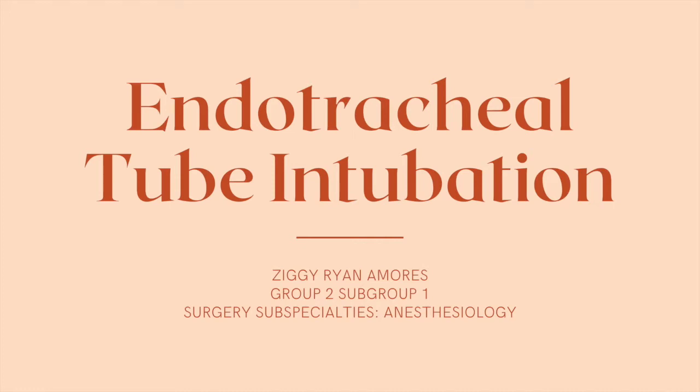Good day, I am Ziggy Amores and I am here to present a simulation video of the endotracheal tube intubation.